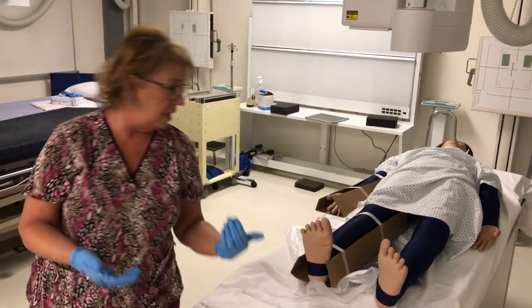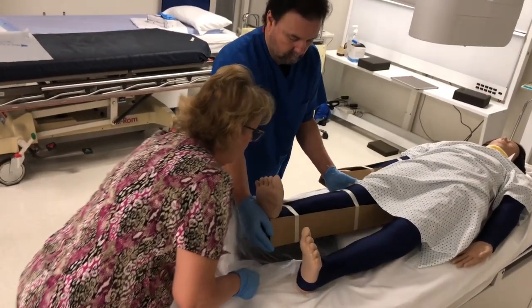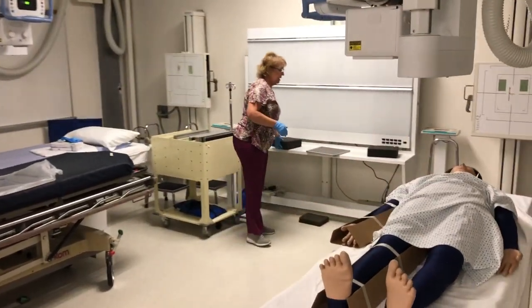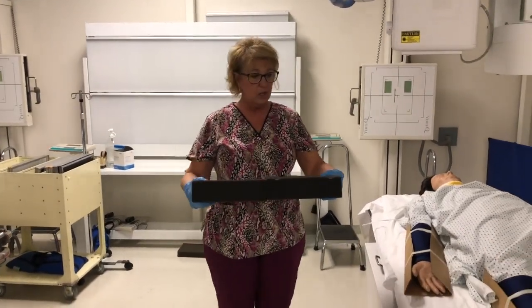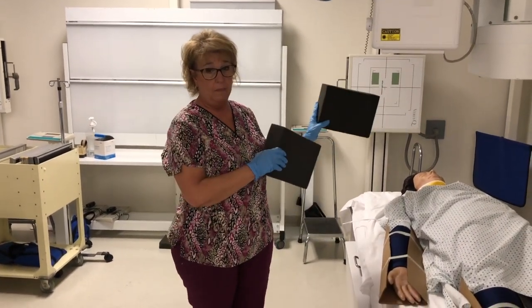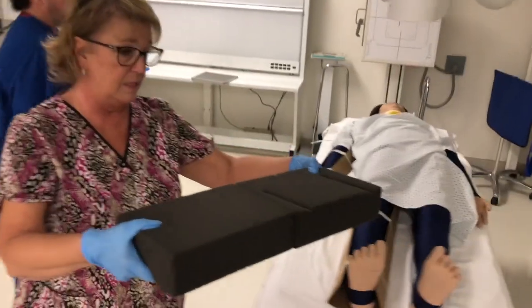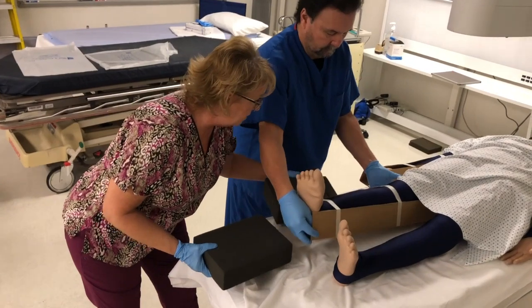So we've done the APs. We're gonna bring our second pair of hands in here, pull the cassette out. Alright, now what I would do is with sheets or some type of protected sponge. Now I finished all my AP views. I'm going to start at the bottom and work my way back up again. So I would have someone lift the limb, and I would place sponges or sheets or whatever you have available under the limb to elevate it.